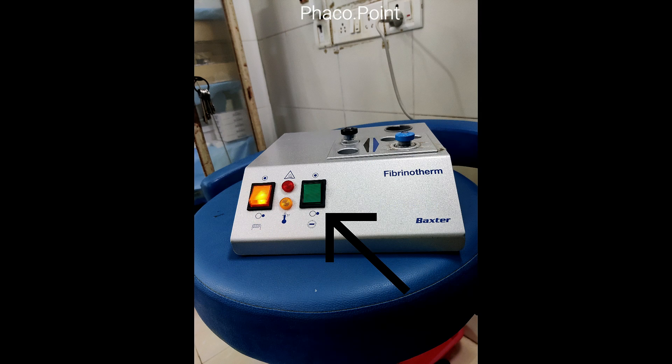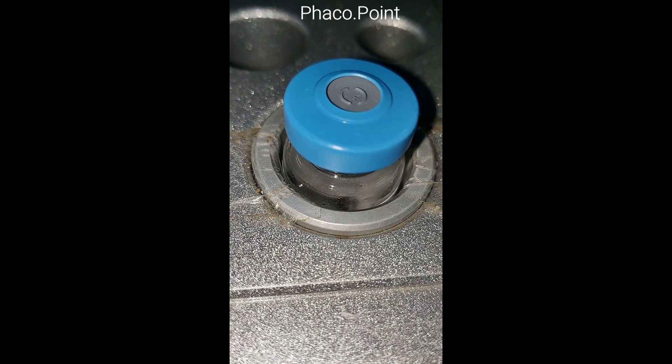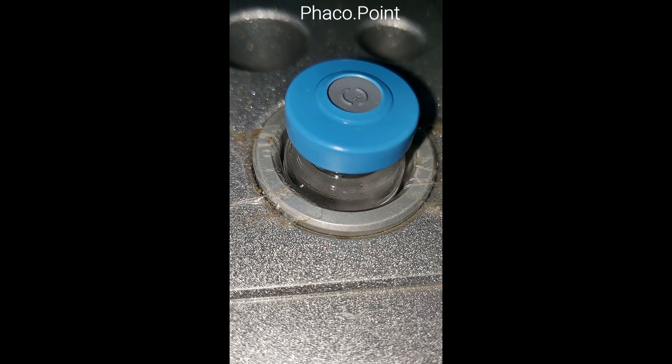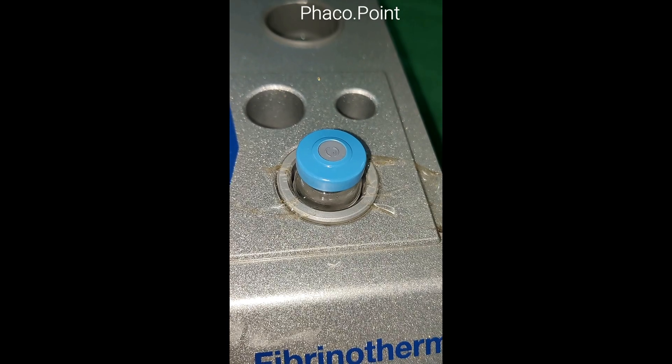The green switch activates the mixer on the Fibrinotherm. Once the mixer is turned on and the reconstituted vials are placed in the appropriate slots, it usually takes approximately 10 minutes of mixing to obtain a complete solution.